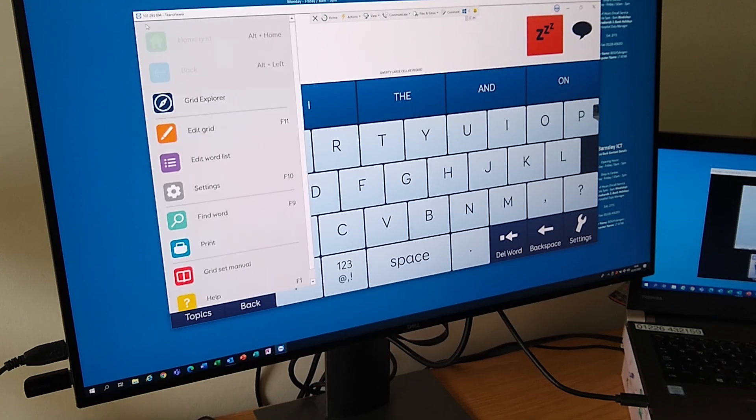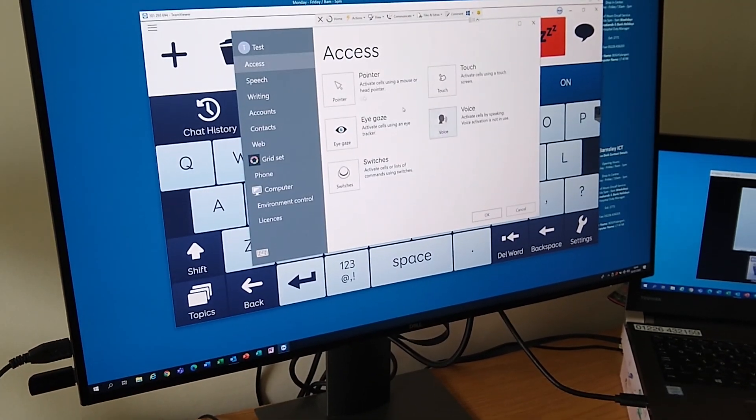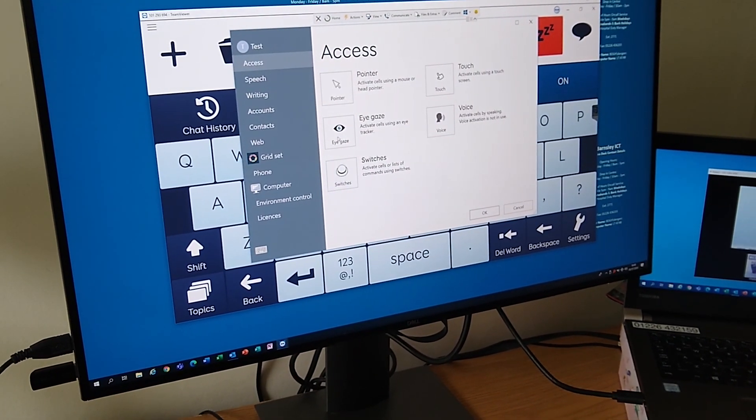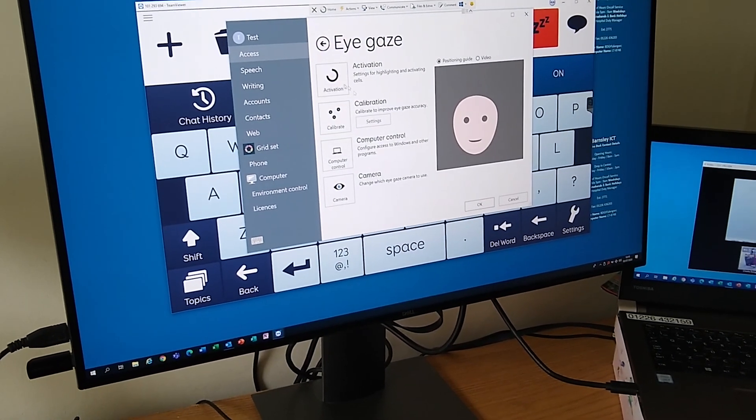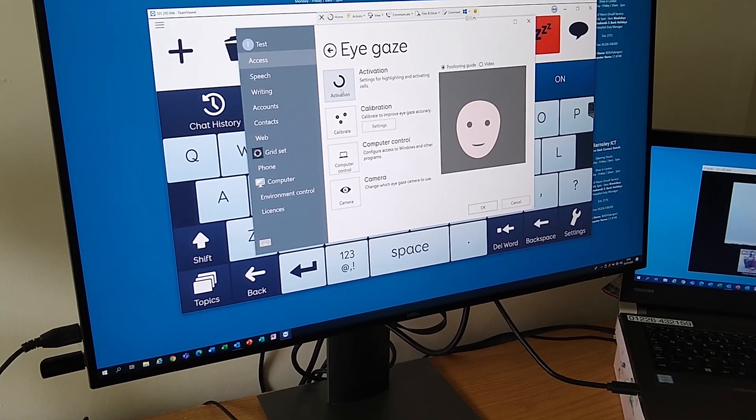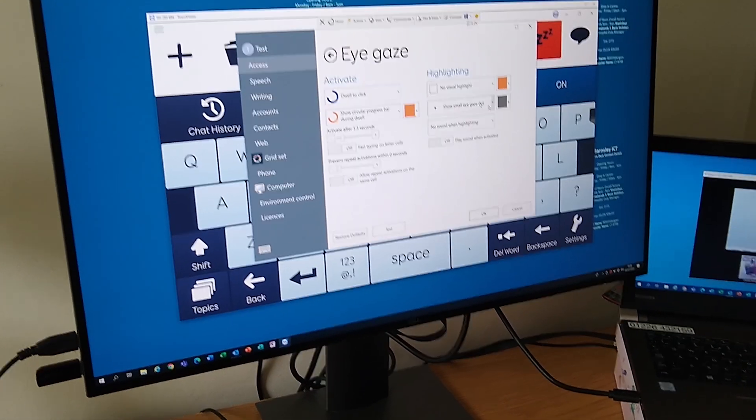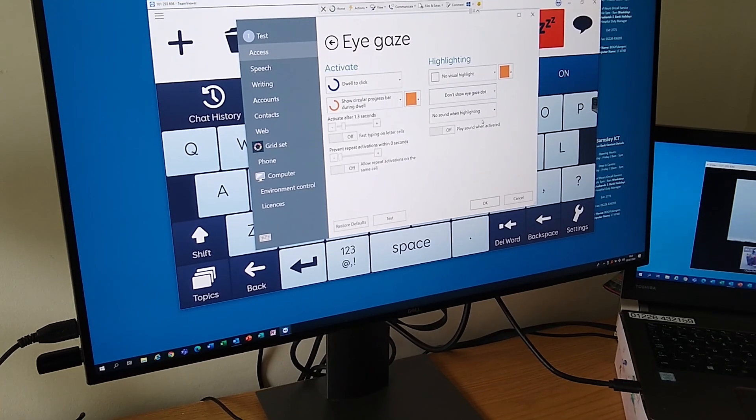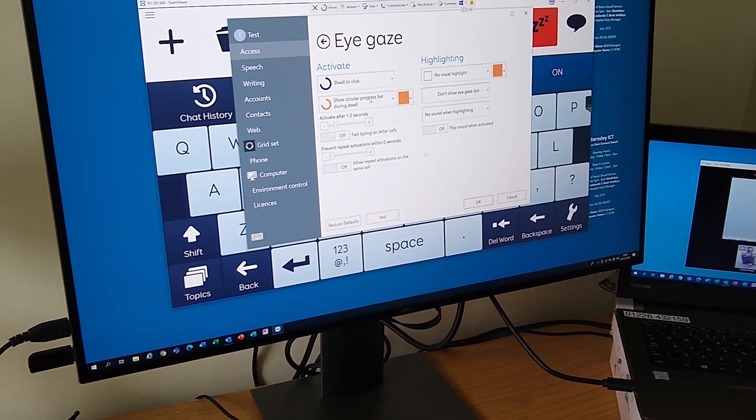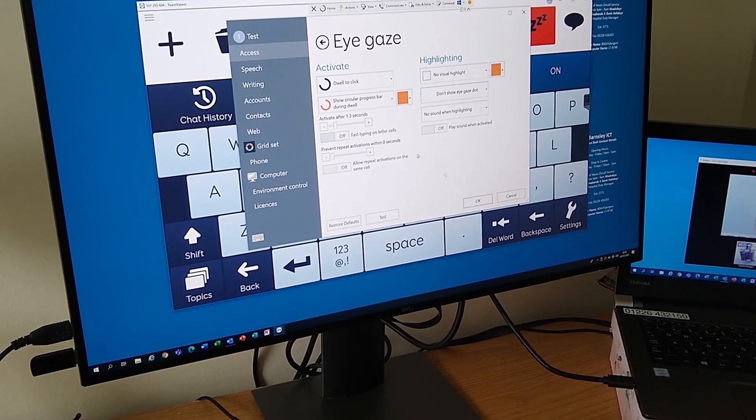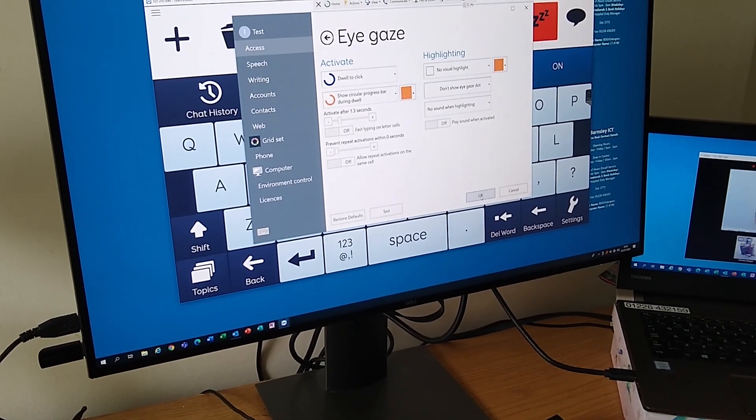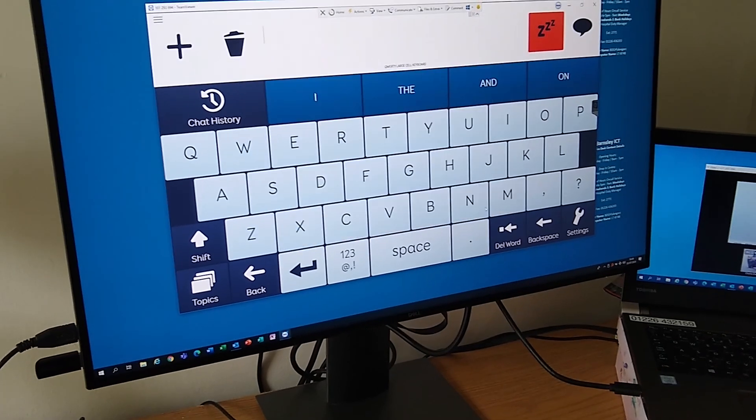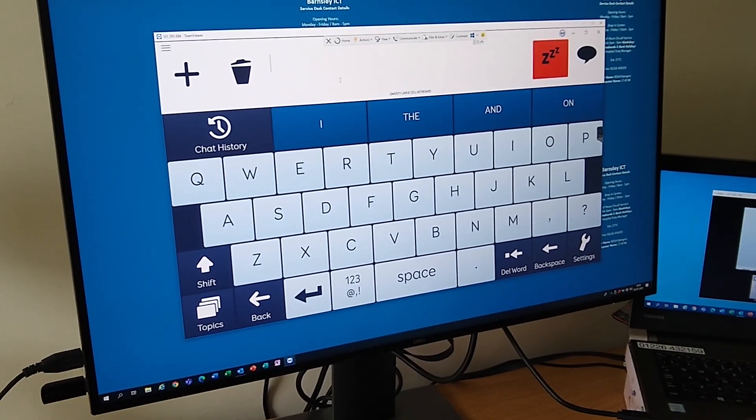I'm just going to turn the gray dot back off again. The gray dot has got its pros and cons. It can really help if you're struggling to get good accuracy, but it can also be a bit interfering because it's quite hard not to look at. So we'll keep with 1.3 seconds, and what I'm going to ask you to do—when I say—I'd like you to have a look at the reset button and then type in a short message for me, please.